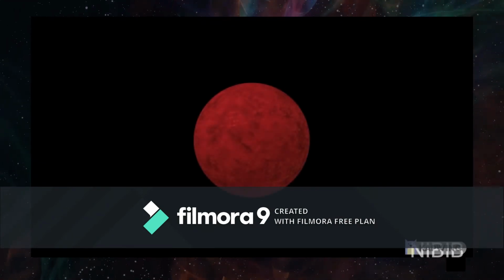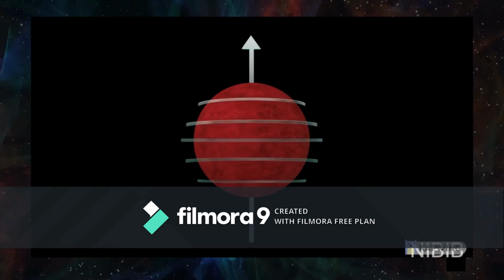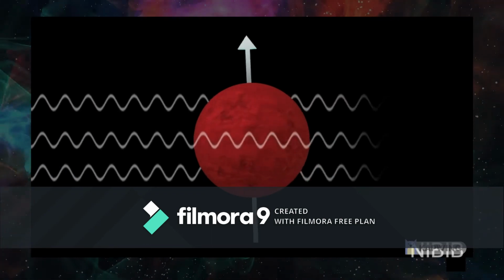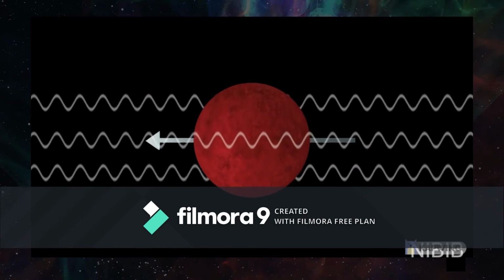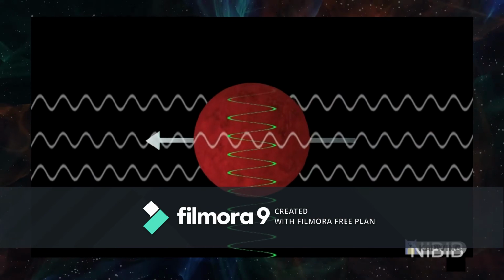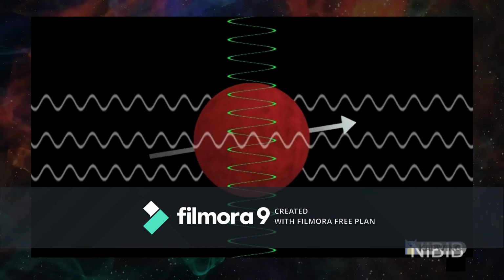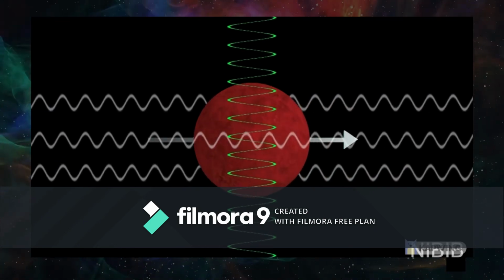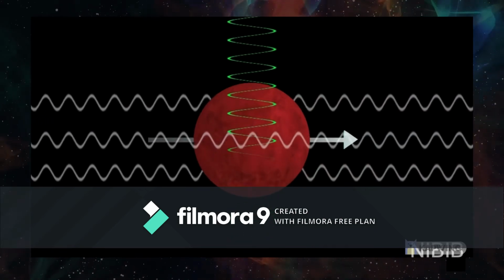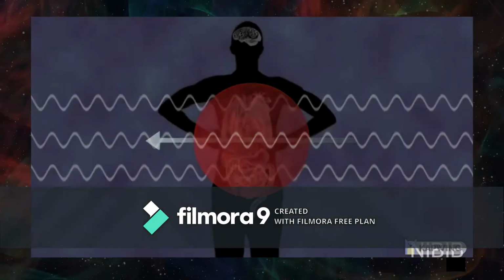Hydrogen protons are used in MRI to produce an image. When an MRI scanner is applied, a strong magnetic field appears. Hydrogen protons move and align with the field. The RF pulse shows up and disrupts the protons and forces them into either 90 degrees or 180 degrees realignment with the static magnetic field. Since the RF pulse pushes the protons against their nature, the protons realign with the magnetic field and release electromagnetic energy.